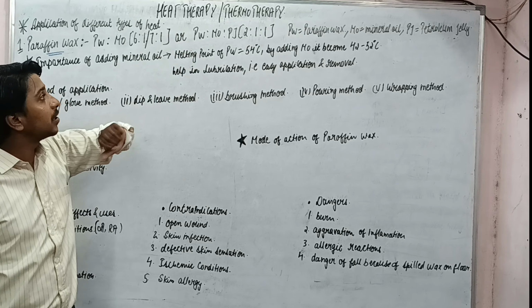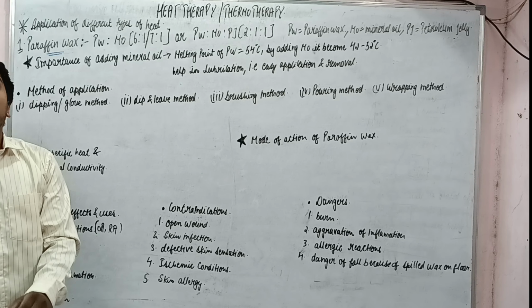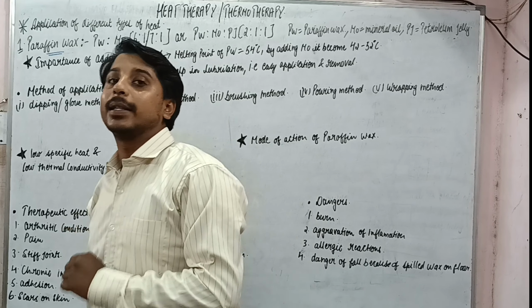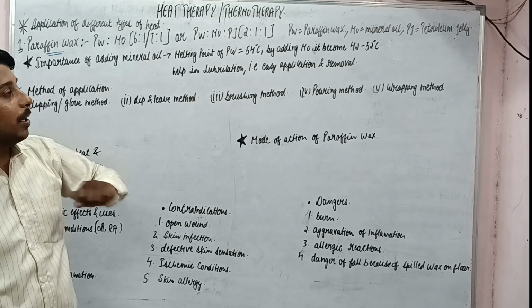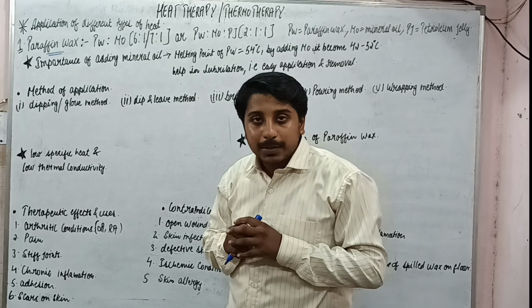Or it is the mixture of paraffin wax, mineral oil and some amount of petroleum jelly, and now the ratio will become 2:1:1. Okay, and petroleum jelly is also used. So this is paraffin wax.